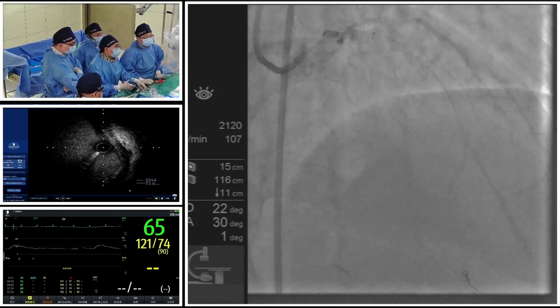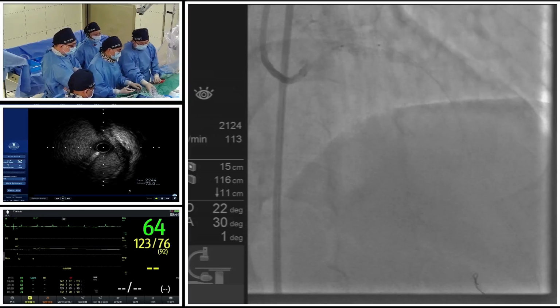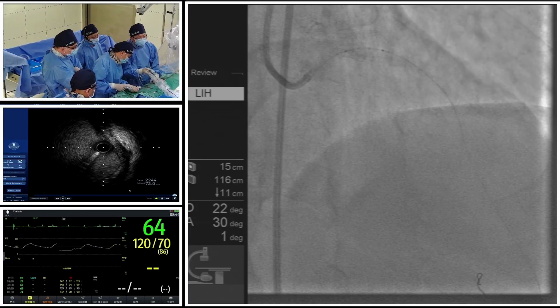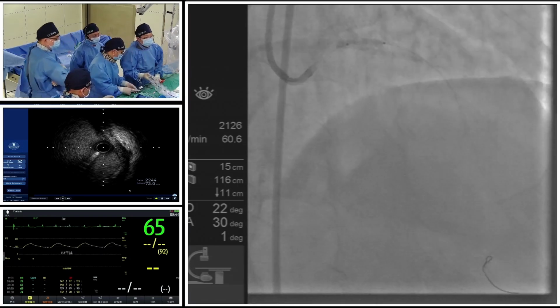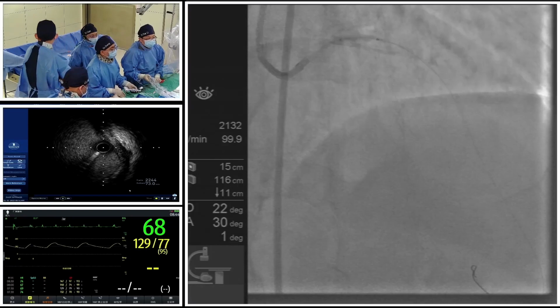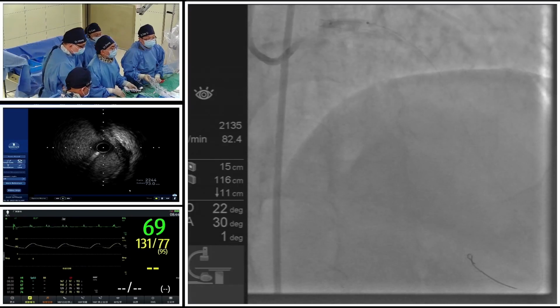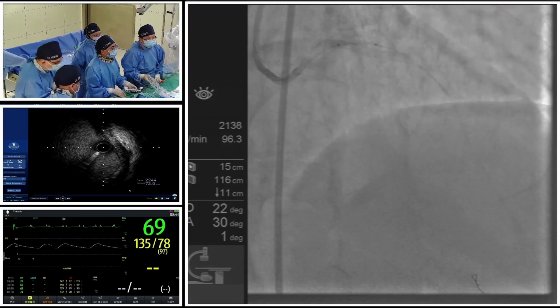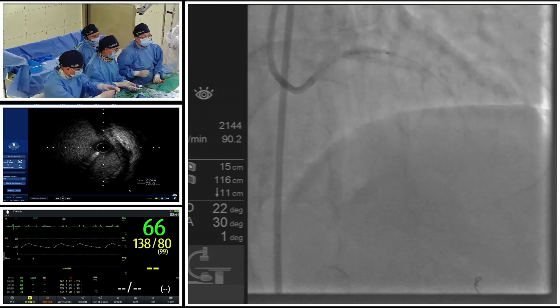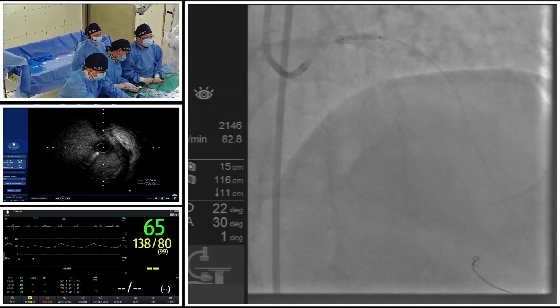So we can see we are not using the IVL balloon to dilate the lesion, but we are just using the balloon to attach to the vessel wall, because the ultrasound can pass through liquid very well, but not gas. Okay, 6.